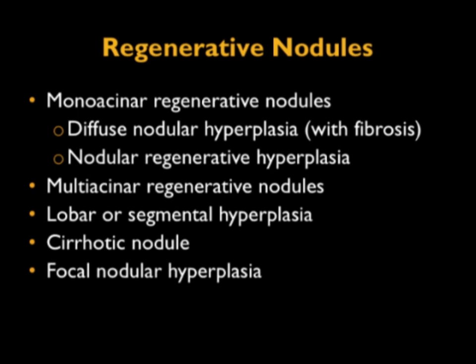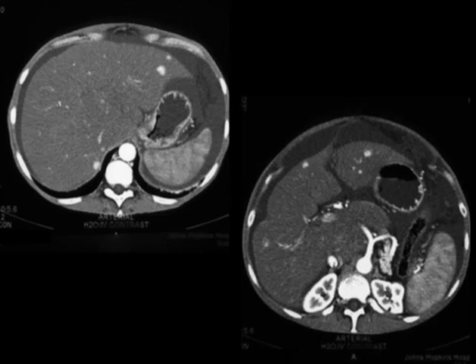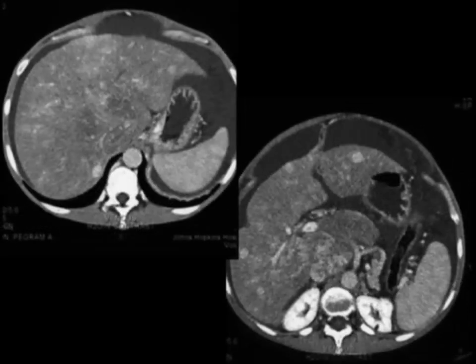If I look at these three or four vascular lesions in this patient with Budd-Chiari syndrome, are those hepatomas or regenerating nodules? Obviously, it makes a difference. Regenerating nodules can be small — they typically are small. They can be solitary or multiple. They can be very vascular, and even on the venous phase, you can still see them as they wash out.